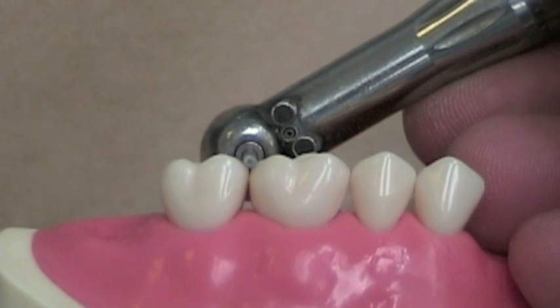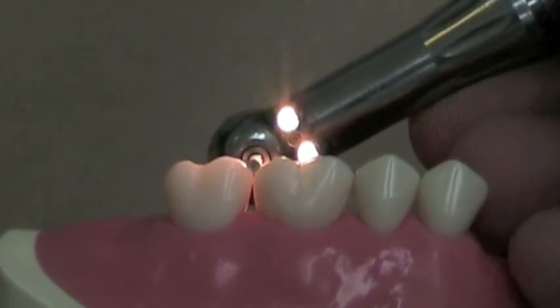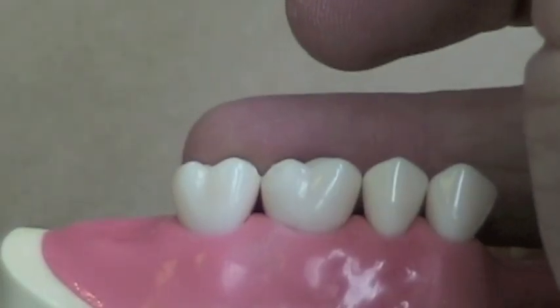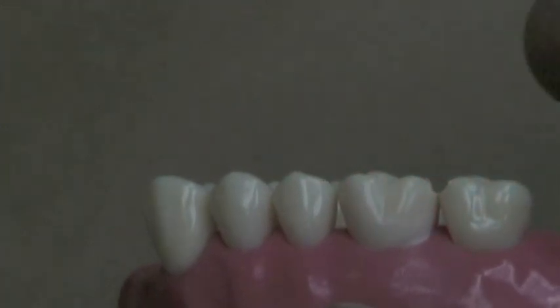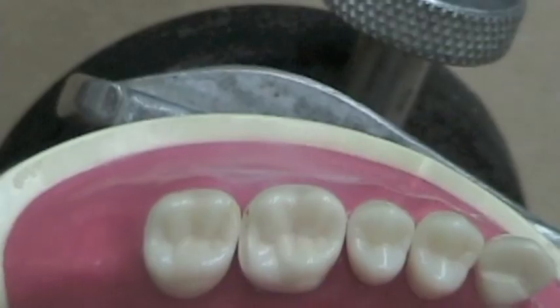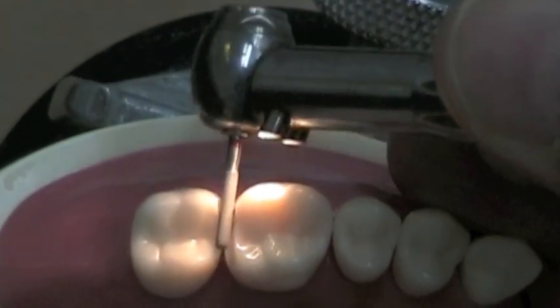To begin the preparation of a double embrasure rest seat, lay your cylindrical diamond burr between the adjacent abutment teeth and parallel with the embrasure. Reduce the marginal ridge height by 1.5mm to provide sufficient clearance for the minor connector and the arms of the clasp with respect to the opposing tooth.